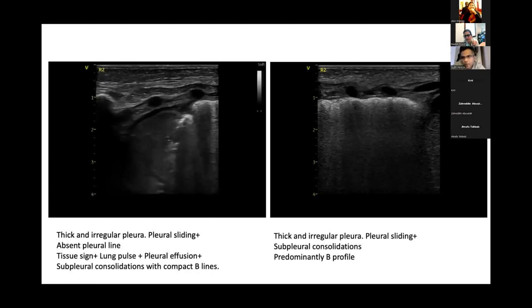And what did the CT scan show? Because this looks like chronic lung disease, but there's no malformation or anything like this. No. They didn't find anything else on the CT chest. It's a bit unusual though, to have the same image persisting at the same place over time, also on your lung ultrasound scans. It doesn't really make sense, does it? Yeah, it's a bit odd.